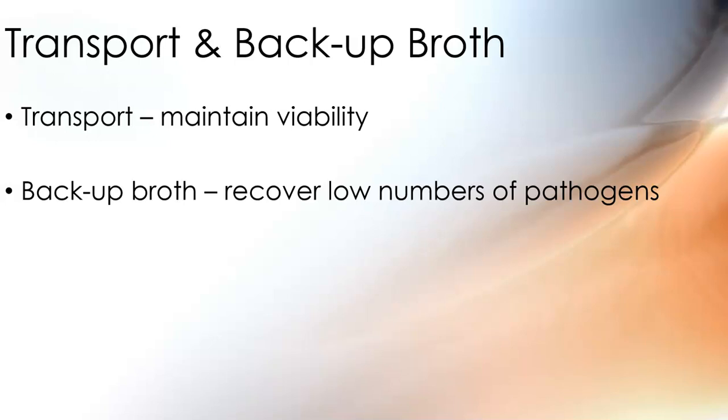In case the organisms are in such low numbers that you're not going to find them on the plates, they'll still grow in the broth, and then you sub that broth the next day to see if you see anything growing on that that wasn't growing on the original plates. Okay. So that's all a recovery thing. It's your backup method, just in case there wasn't a lot of them.